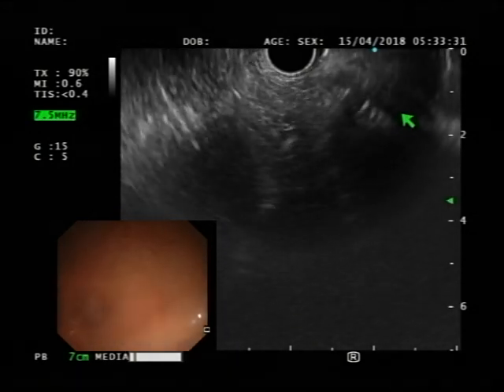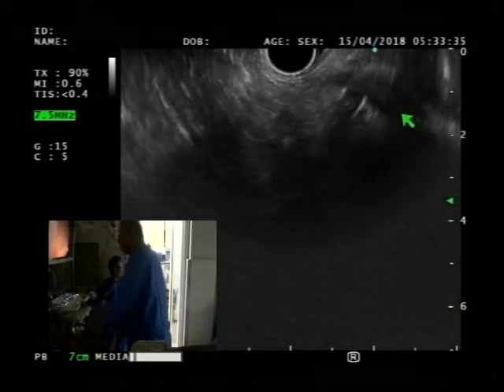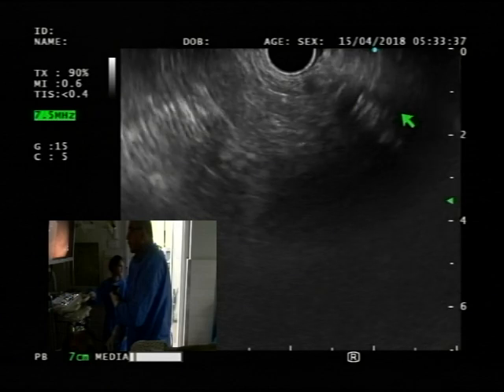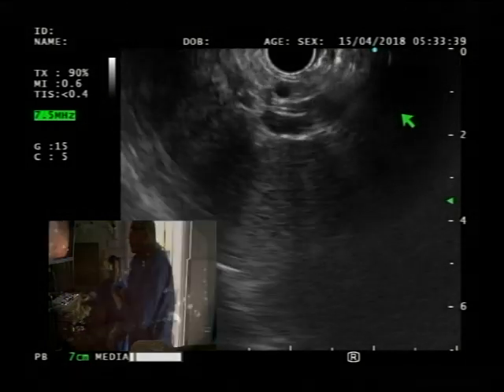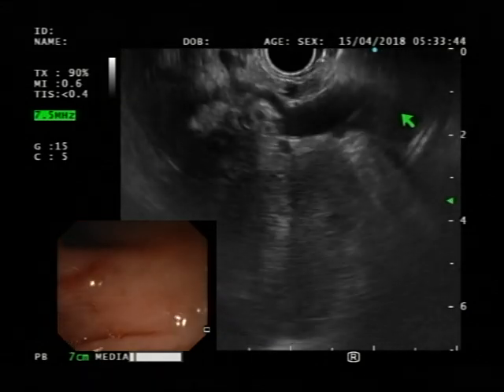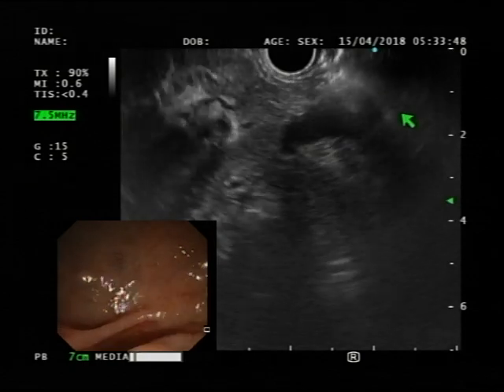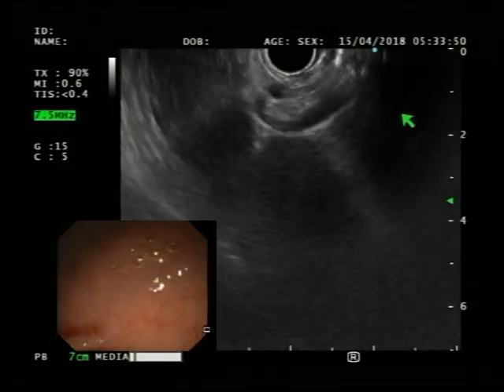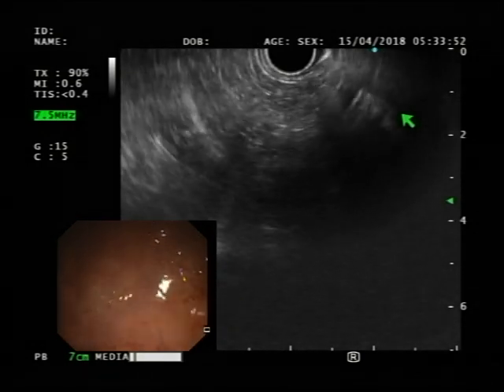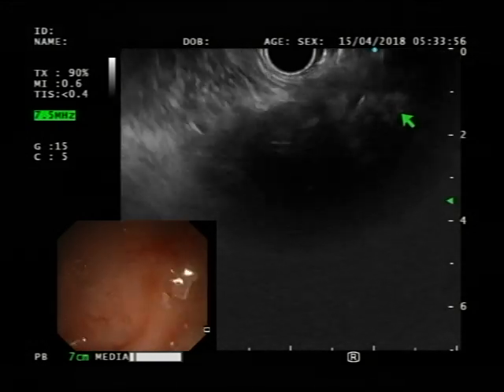So go clockwise and then counter. Go clockwise. Yeah. Kidney, I think. So go counter. So we're way too far. I think we may be in like distal bulb.